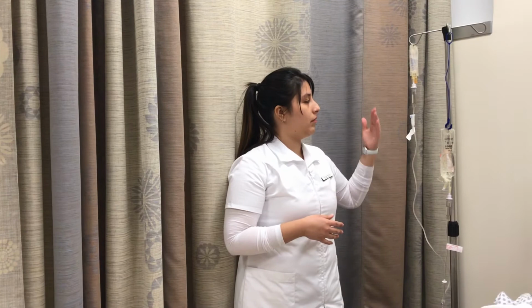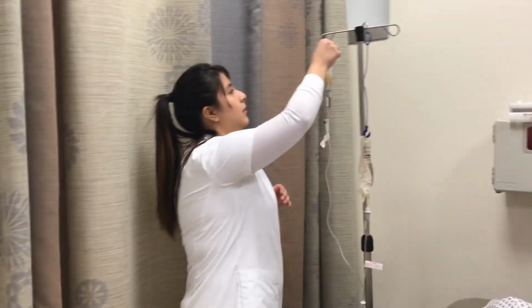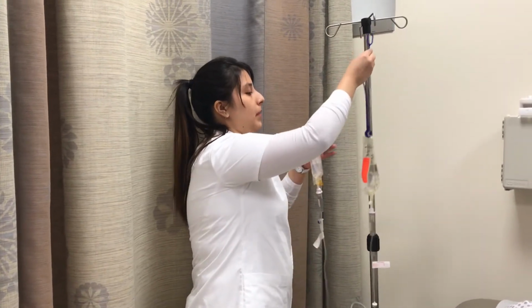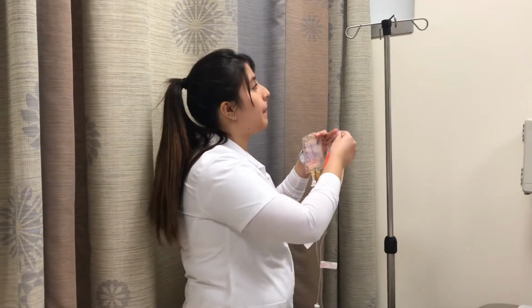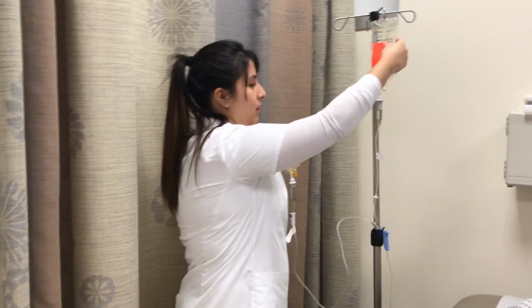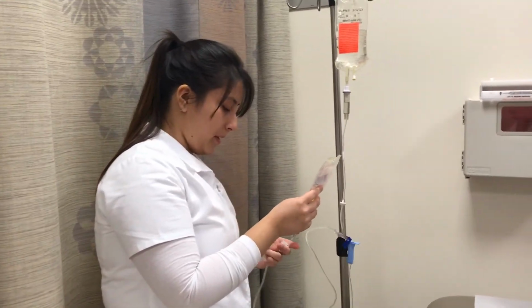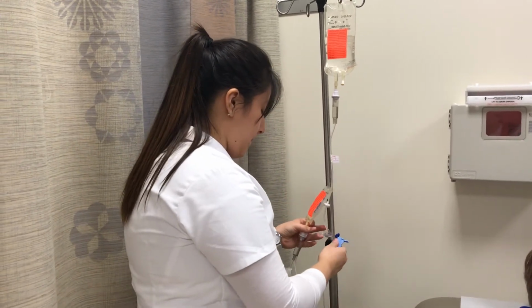I will be removing the IV piggyback, to assess for the odor, amount, color. Should be okay. So after placing my primary IV back into its original height, and then make sure there's a label, wash my hands, and initial, time, and date. Get my sterile gloves. Clamping my IV piggyback.